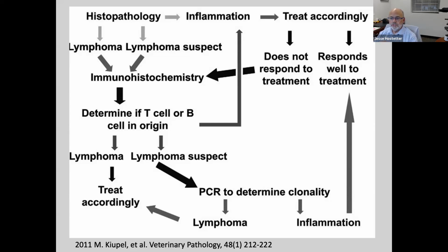Probably what I would recommend in that case is PARR. You'd also have to think, is it some kind of neuritis in the intestinal wall? That's a confusing one. I've not seen that before, but I think PARR might be able to help you tease out whether that's an inflammatory population or a neoplastic population.